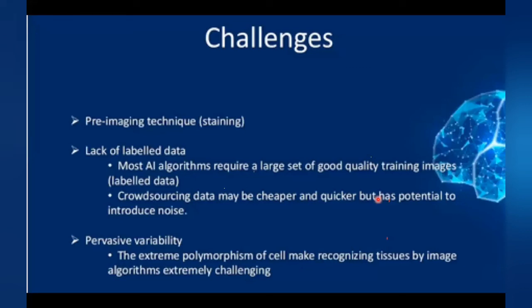A couple of months back, I saw a scanner where they broke the slide into 20 pieces, put a cover slip on it. It could still sense the tumor tissue. It can still mark the region of interest. And they have become so good nowadays. So I think with time, this limitation will be going off.